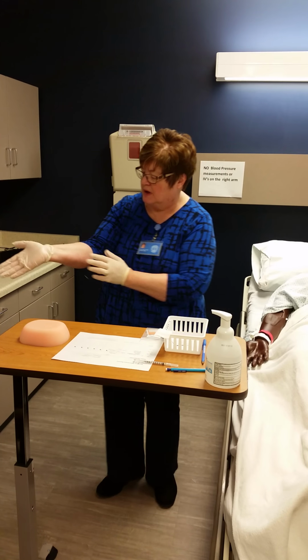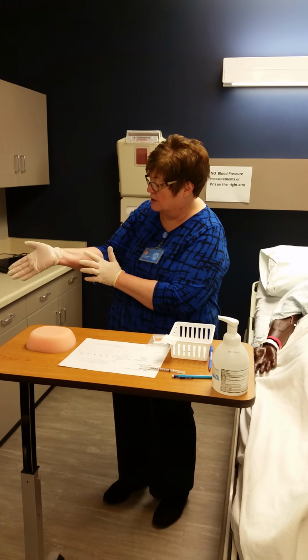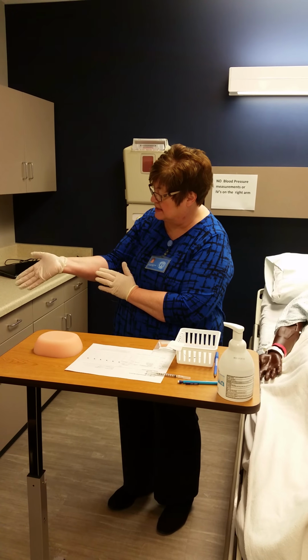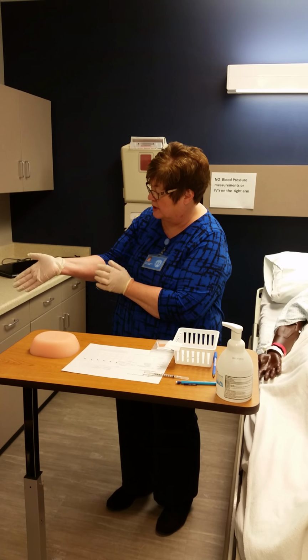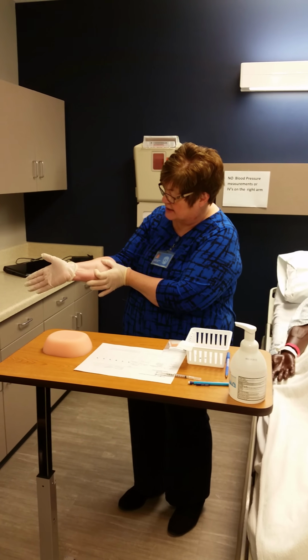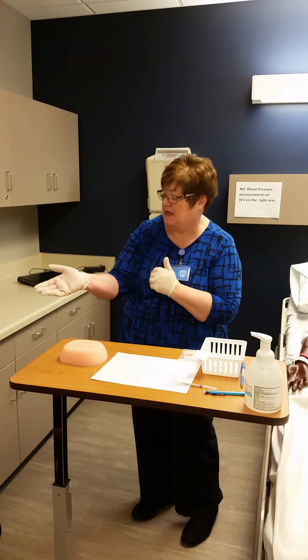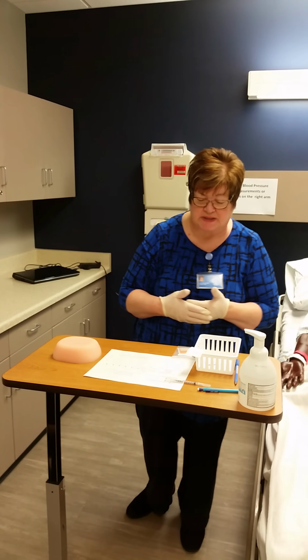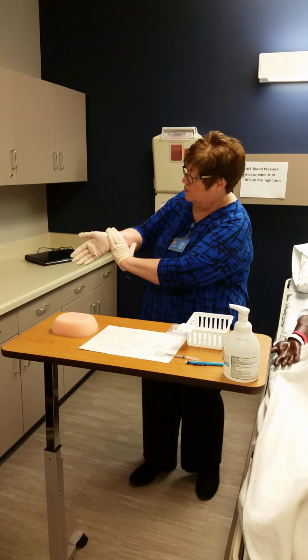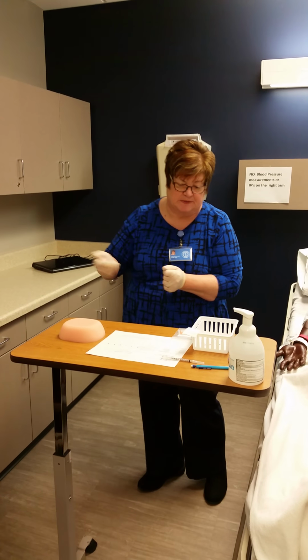And so giving you the arm, we're looking again that there's no veining present here, that there's no moles at all, that there's no scar tissue, no tattoos present. I'm looking for basically pristine skin, and so probably in this area is where we would go. We also have to pull the skin taut, so you'll come next to the skin and then pull it taut like that so that you can get the needle to go underneath just the very top layer of skin to create that wheal. Otherwise, you might go into the subcutaneous layer. Okay, another thing that you need to do is we always put a hand at the wrist and a hand at the antecubital. So this is the area that you'll be looking at for that skin surface.